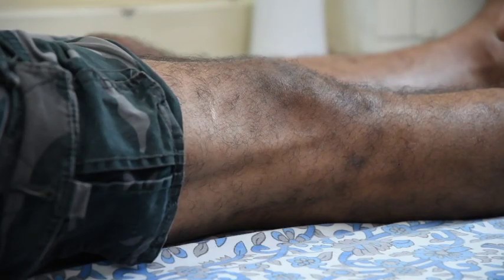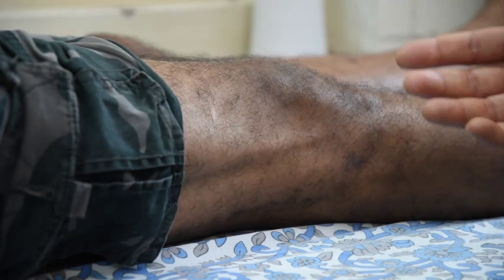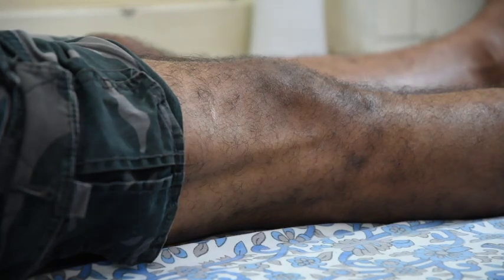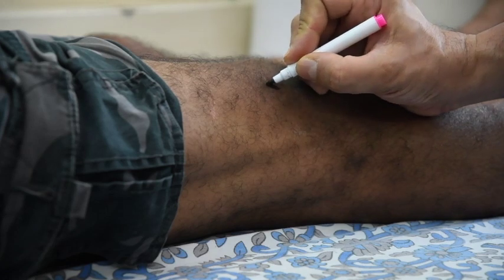We will now move on to actually demonstrating the procedure on a patient. I am going to describe the first technique, which is the superior lateral approach to the knee. Make the patient lie supine. Prepare the part with alcohol solution and make it dry. Once dry, use sterile gloves. For the sake of demonstration I am just marking this, but you should be using a no-touch antiseptic technique. With gloved hands, palpate the patella. What I am marking now is the superior pole of the patella.